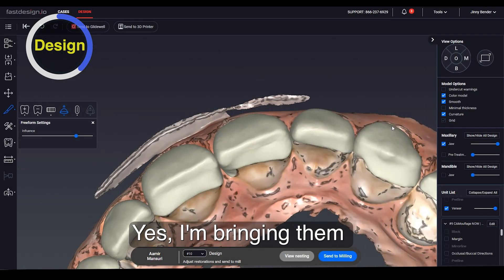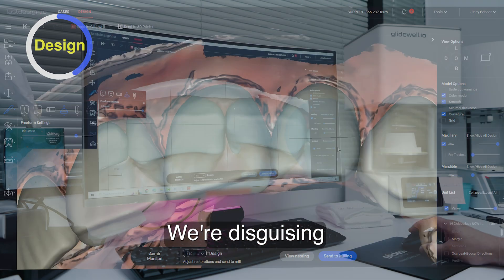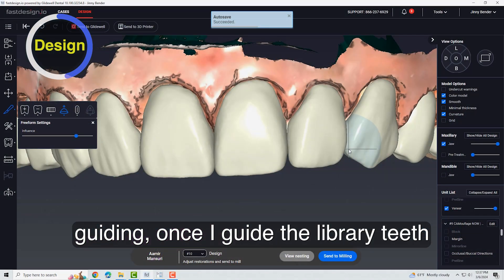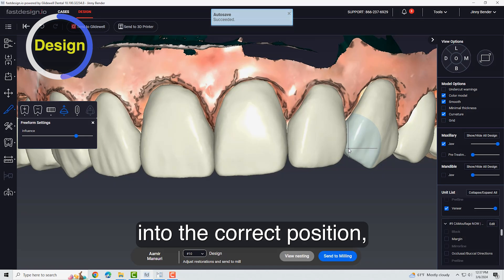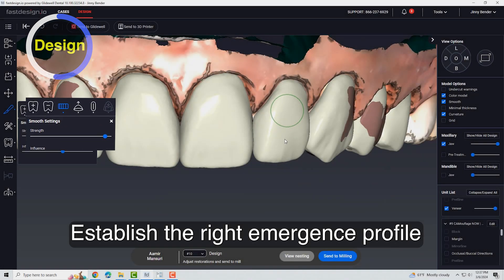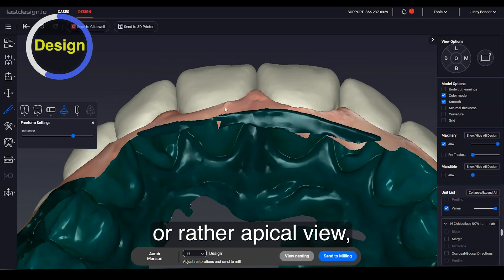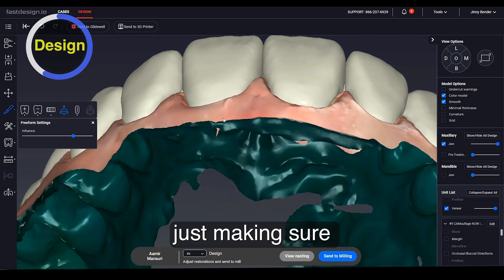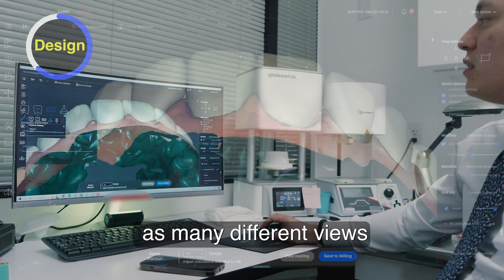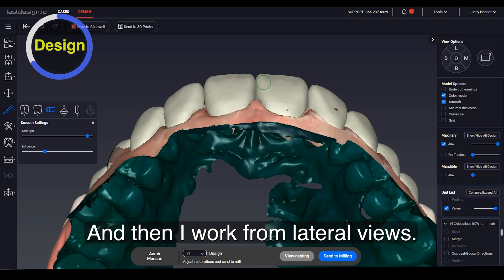You can see the finish lines. I'm bringing it a little more facial, but that is kind of what we do — we're disguising the original position of the teeth. So using the tools, guiding, once I guide the library teeth into the correct position, then I use that freeform feature to establish the right emergence profile. I create the right contact areas. I check it from the incisal or rather apical view, just making sure all of the designs flow well with one another. You want to ensure that you check it from as many different views as you can, starting from the facial and then working from lateral views.